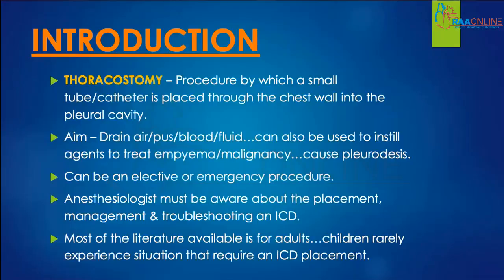Right, to begin with, thoracostomy. What is it? It's a procedure by which a small tube or a catheter is placed through the chest wall into the pleural cavity. Now, the tube can be small sized or large sized depending upon the indication. I'll be coming to that.